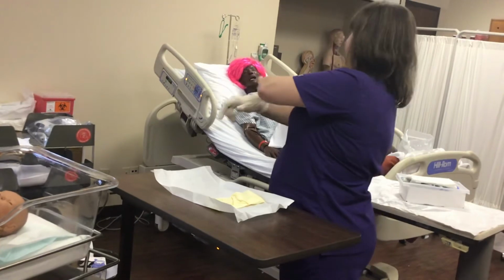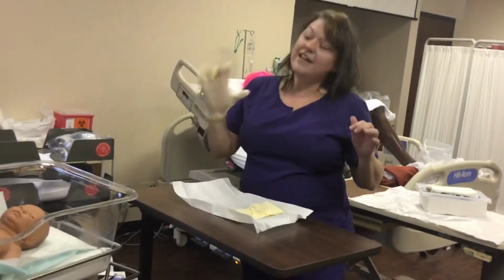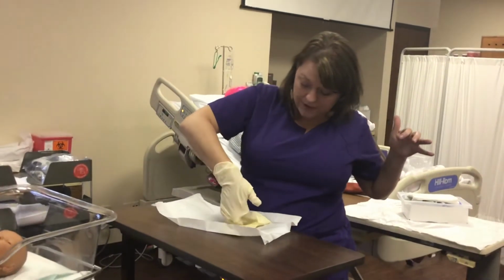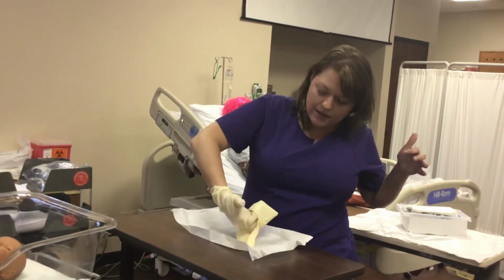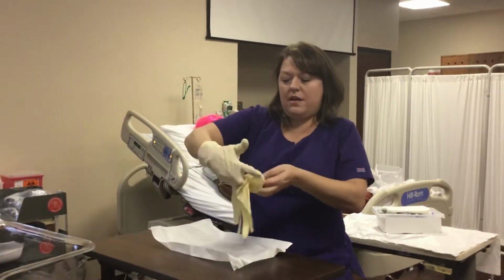Yes, Mrs. Shelton, the gloves are always the hardest part, especially for me. Now I know this glove is messed up, but that's okay, because once I get this glove on, then I can straighten it out. So now I'm going to go under the cuff, keeping my thumb out and making sure that I do not touch the inside cuff of the glove, and I'm going to glove my non-dominant hand.